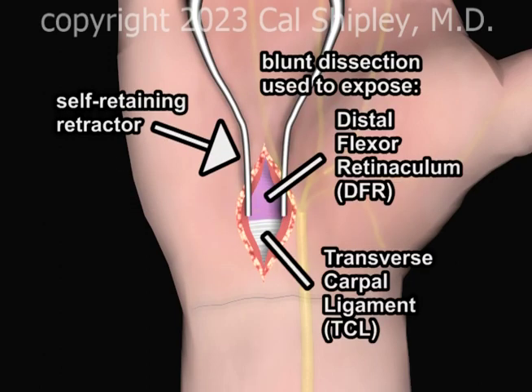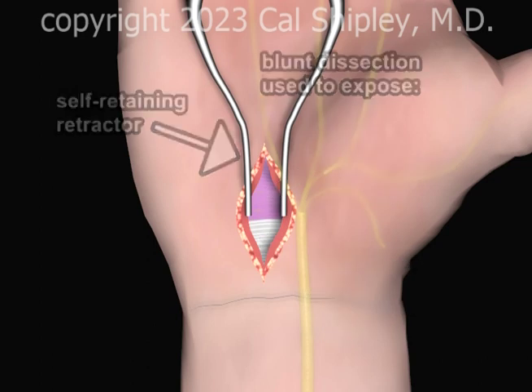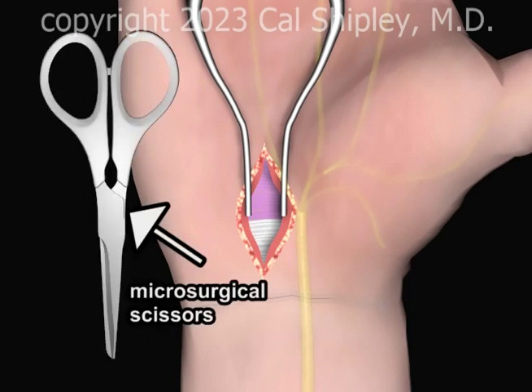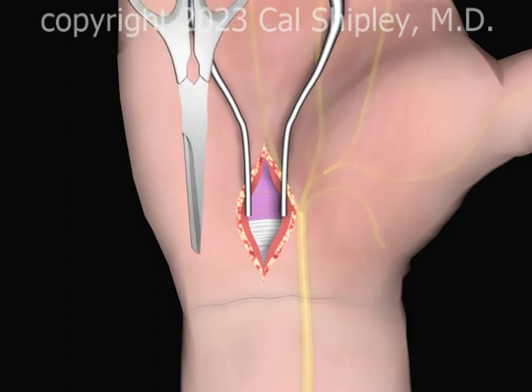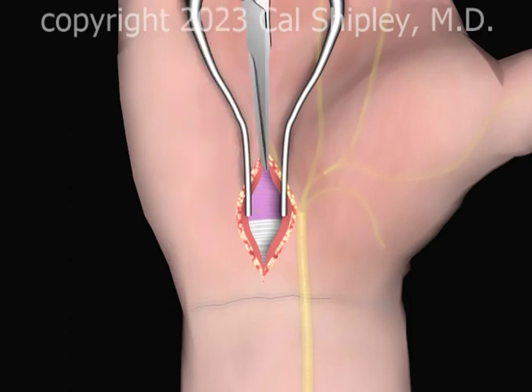Blunt dissection and a self-retaining retractor are used to expose the distal flexor retinaculum and the transverse carpal ligament. Microsurgical scissors are used to open the distal flexor retinaculum and transverse carpal ligament.